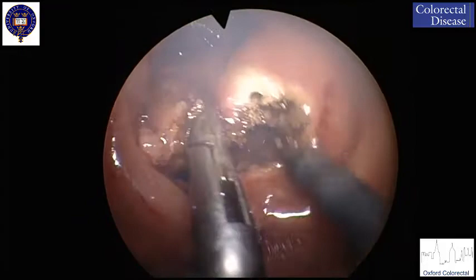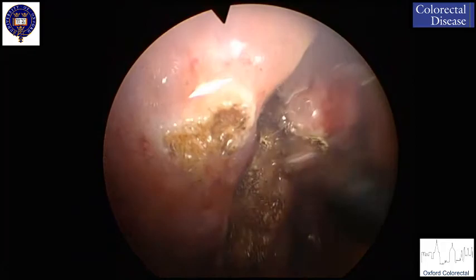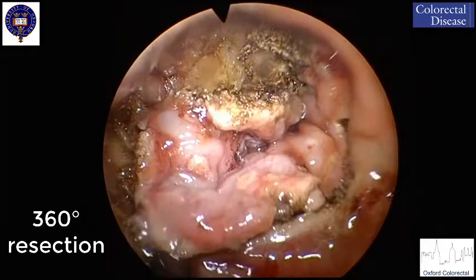Due to the perforation, we experienced a brief loss of pneumo rectum while the pressure in the intra-abdominal compartment equalized, resulting in a less optimal exposure of the operation area, leading to a more extended 360-degree resection.